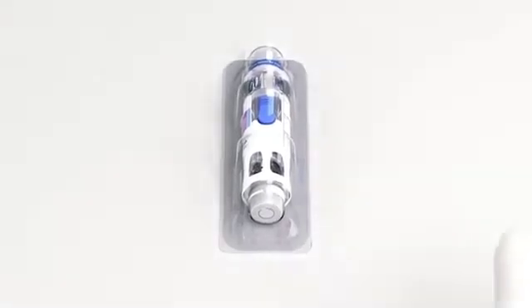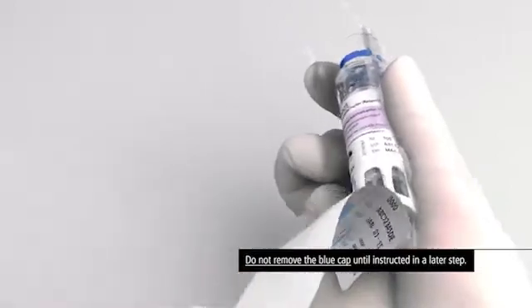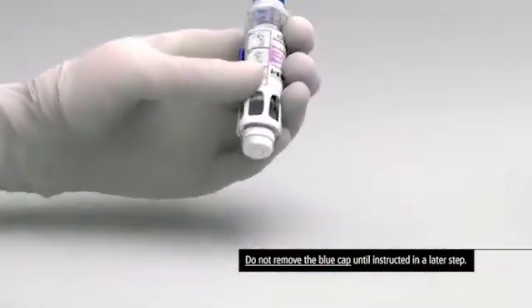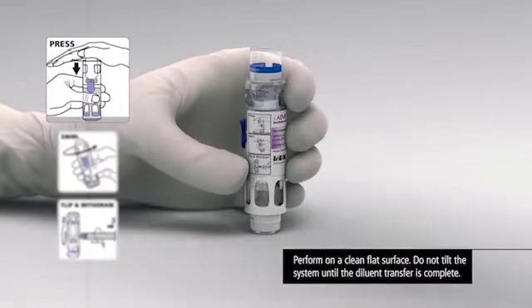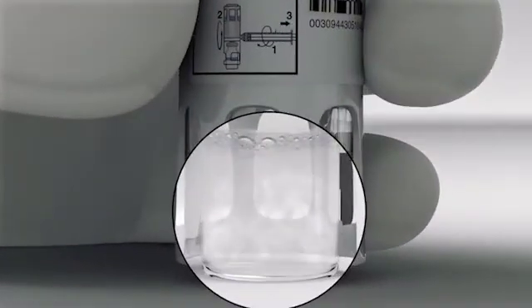Remove ADVATE with BAXJECT III system from the packaging by peeling away the lid and set it down on the flat surface with the diluent vial on top. You can identify the diluent vial by the blue stripe. With one hand holding the ADVATE housing, press down firmly on the diluent vial with the other hand until the system is fully collapsed and the diluent flows down into the ADVATE vial.